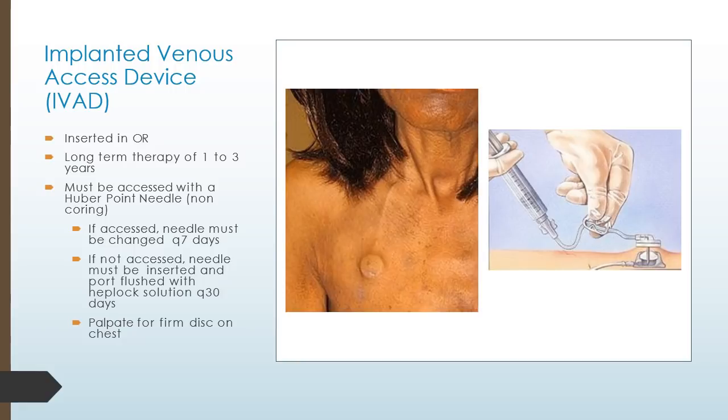towards his neck there. In pediatrics, you actually can put a numbing cream on there ahead of time before you put the needle in place. And that's what the needle looks like, that second picture there on your right-hand side. That's what the needle looks like. In your lab practice for this week, you will actually have the opportunity to take a look at one of these.